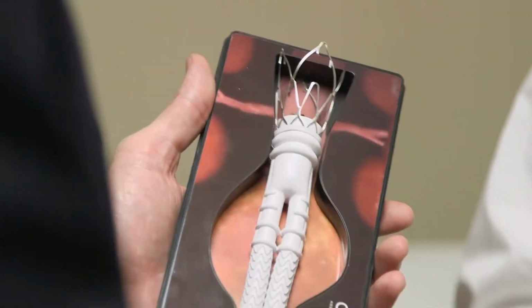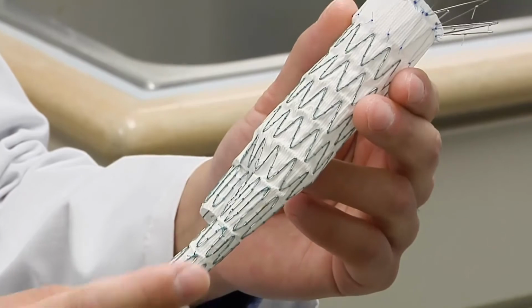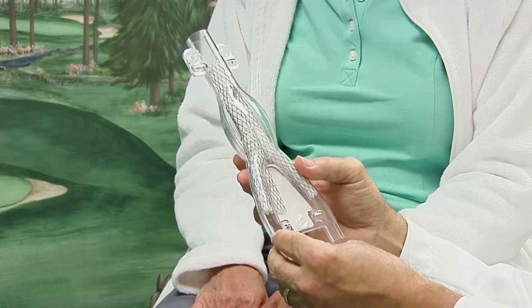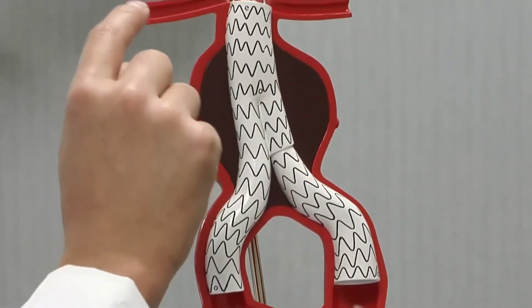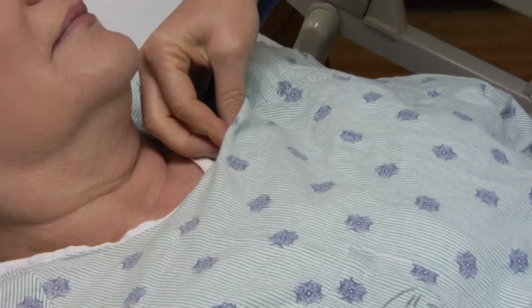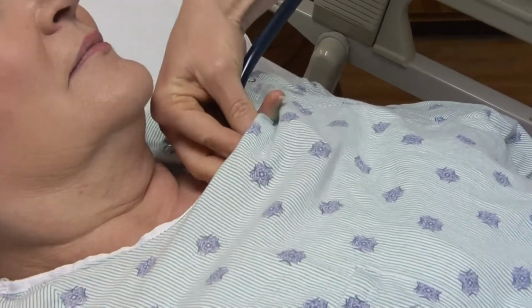But because the aorta has many vessels that branch off of it and the distance between branches is unique for each person, a more individualized solution is now available. We now have the technology to punch little holes in those metal stents covered in fabric that allow us to put other covered stents through those tiny holes out to the target vessels, actually build a graft custom for an individual patient. This device helps patients avoid the risks of a major chest or abdominal surgery.